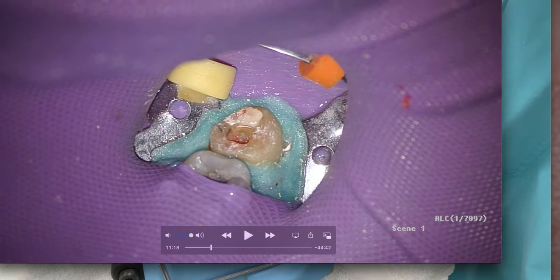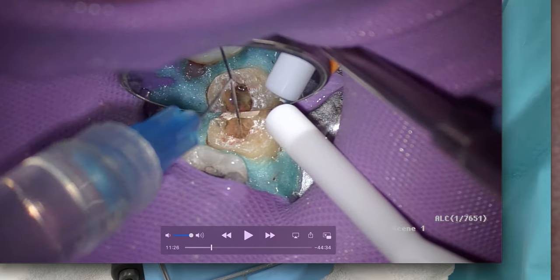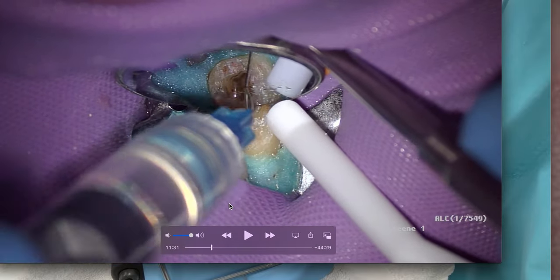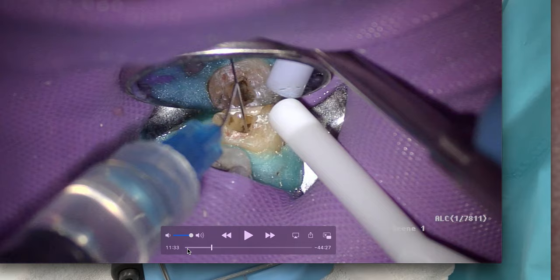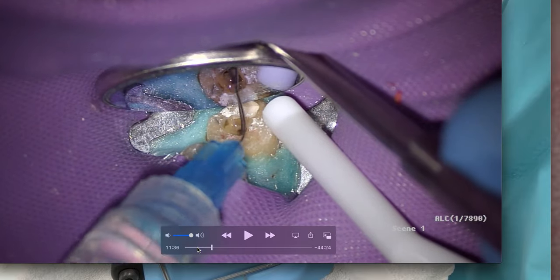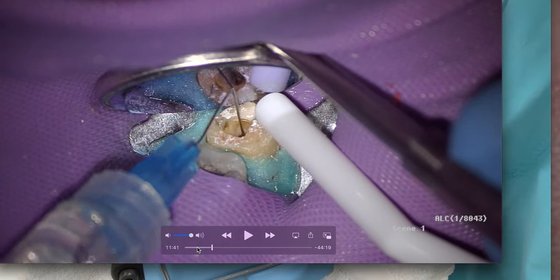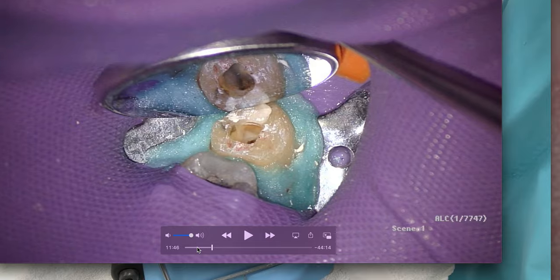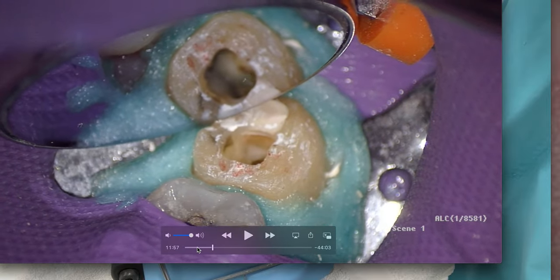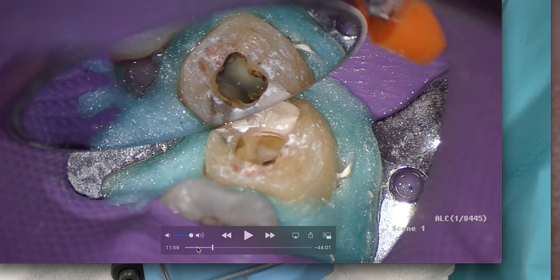We're opening, cleaning, and shaping — I'm orifice-opening, cleaning and shaping the coronal two-thirds, which is a fairly standard technique to get my hand files down and get working length. You can see all that pulp tissue is out. That was about five minutes for the access. Now we know we've got two mesial canals and a large distal canal.